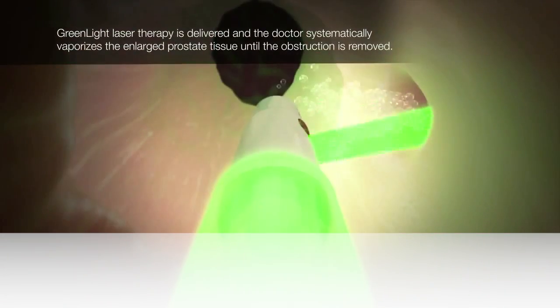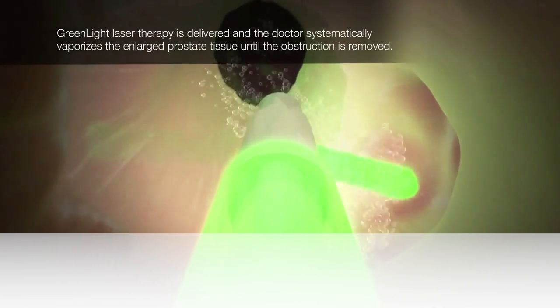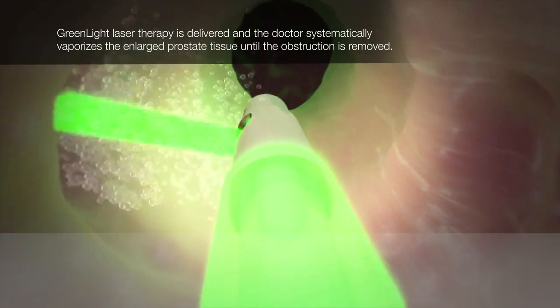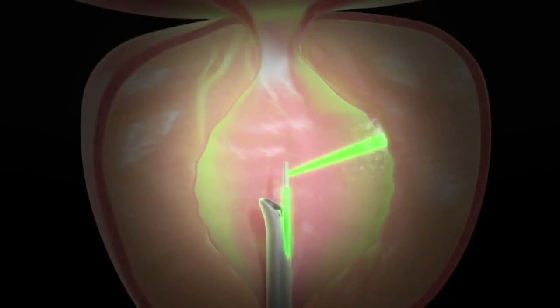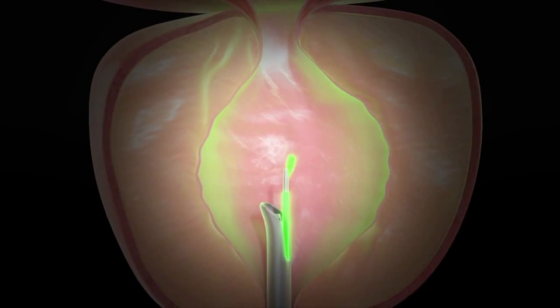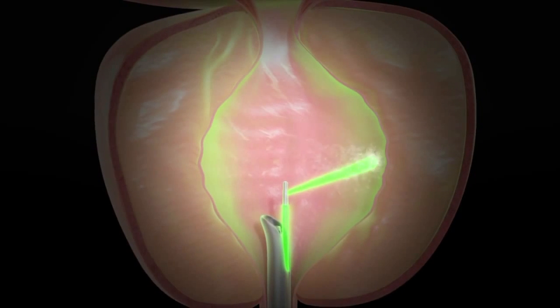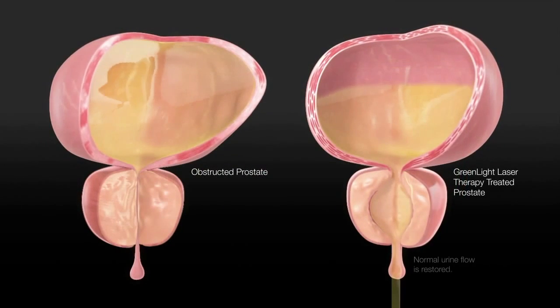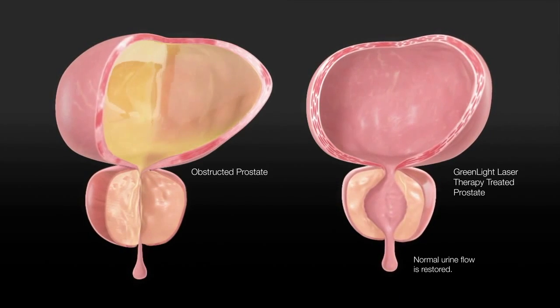Greenlight laser is one treatment option. Here a laser fibre is fired at the prostate tissue, causing vaporisation of the central portion of the prostate, reducing the blockage and allowing urine to flow more freely. The wavelength of the laser means it is selective for haemoglobin in tissues, meaning there is effective and immediate vaporisation of tissues without necrosis, so scab formation is minimal. Outflow resistance is reduced and urine flow is improved.